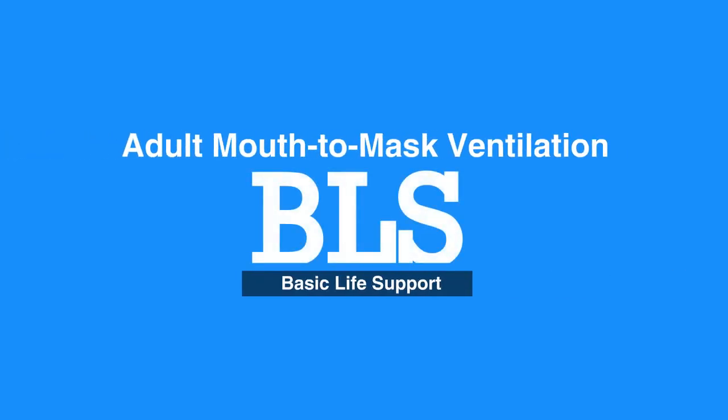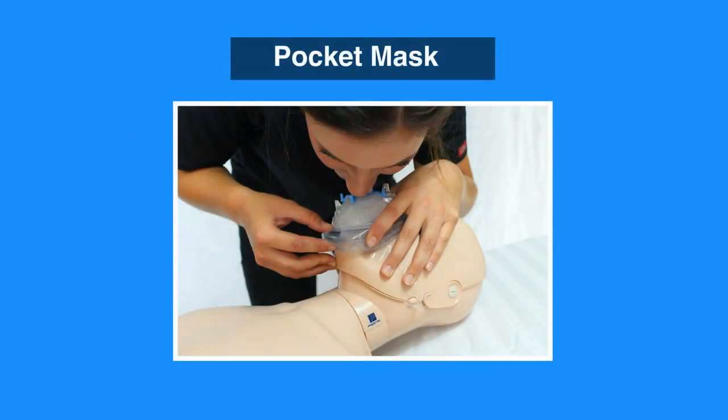Welcome to the adult mouth-to-mask ventilation. In this video, we will discuss the use of a mask to deliver breaths in one rescuer's CPR. Breaths should be supplied using a pocket mask if it's available.